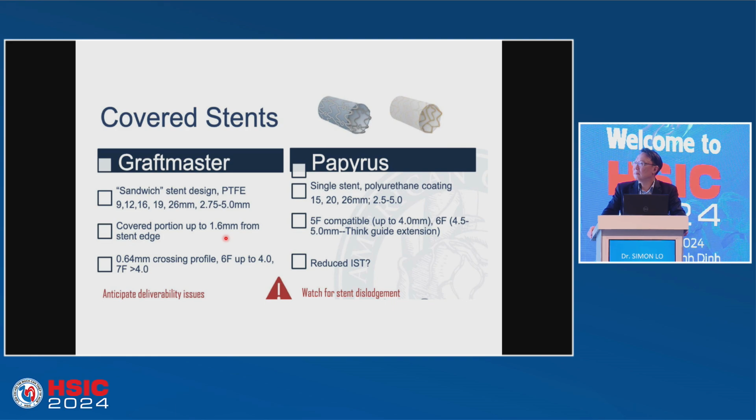Yeah, and the GraftMaster is out of the market now. Also, when doing high pressure ballooning while you expand the GraftMaster, it then shortens. It has foreshortening, 20% foreshortening, and it probably also foreshortened by 5-10%. Yeah, good point.